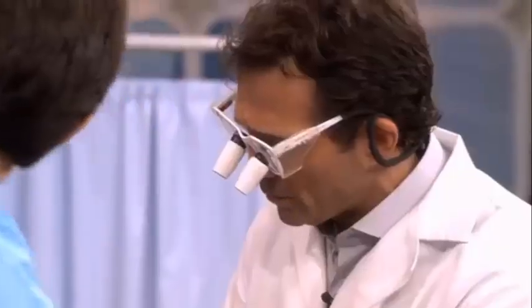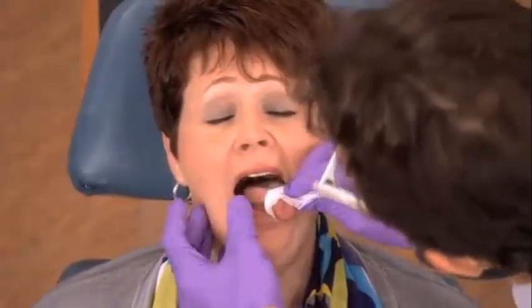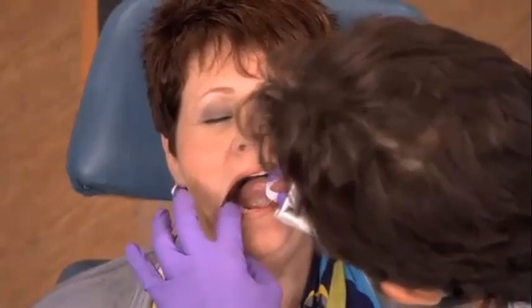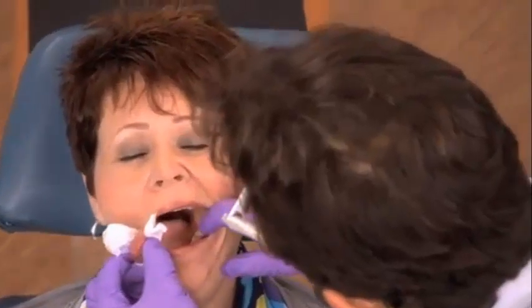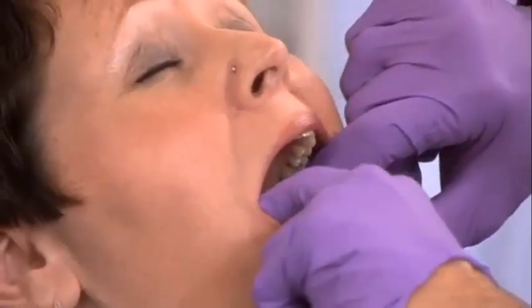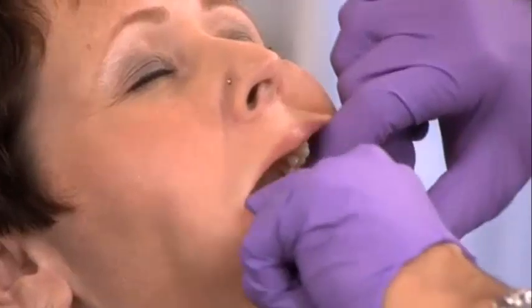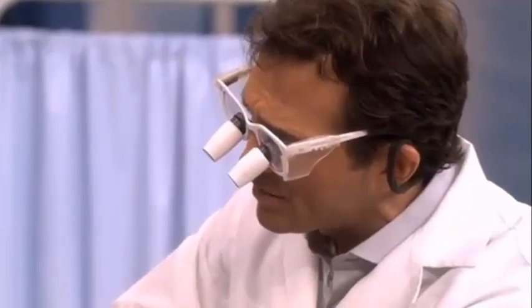And now stick out your tongue, and the traditional way we use this gauze as a tongue lasso, we go right around the tongue, and we're able to see the sides of the tongue, underneath the tongue, towards the floor of the mouth, left, right, and we'll say ah, and we're looking for any unusual red or white spots, any dark spots in the mouth.